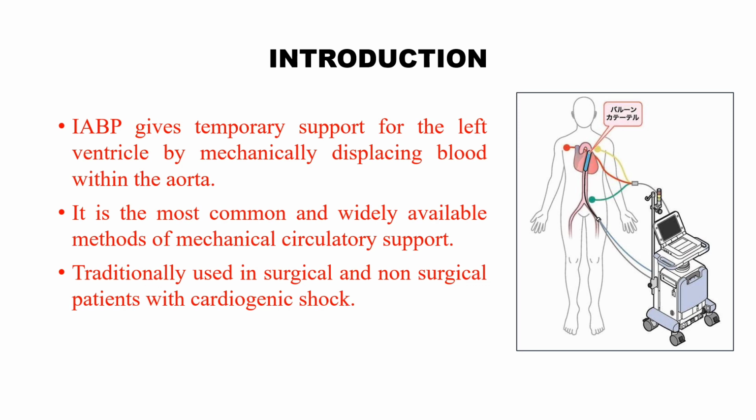What is IABP? IABP gives temporary support for the left ventricle by mechanically displacing blood in the aorta. It is the most common and widely available method of mechanical circulatory support. Traditionally, it is used in surgical and non-surgical patients who have cardiogenic shock.